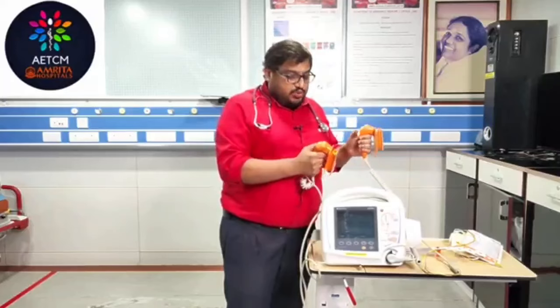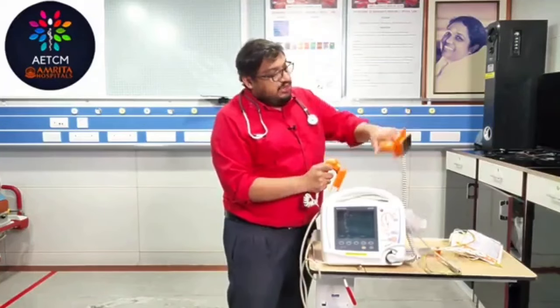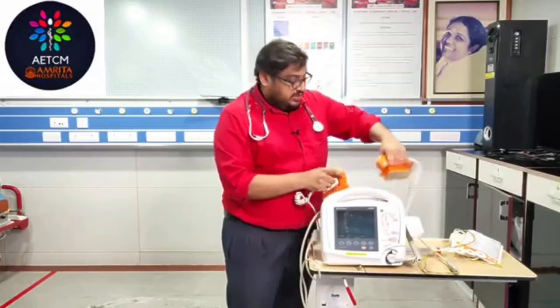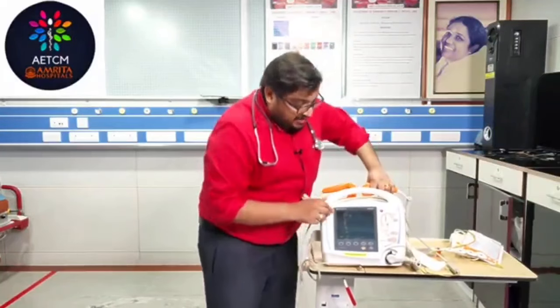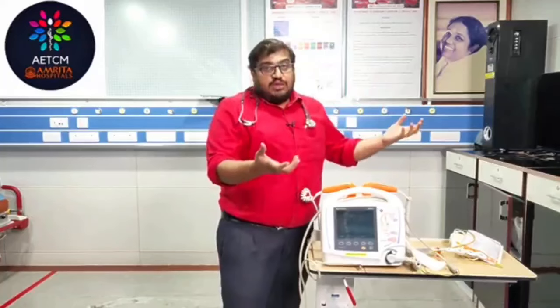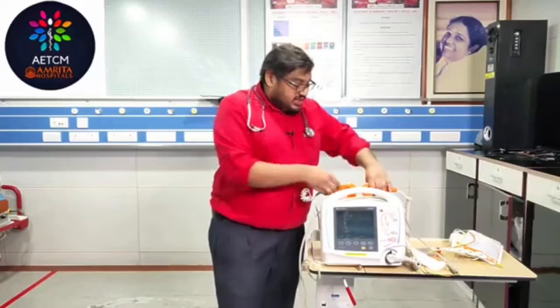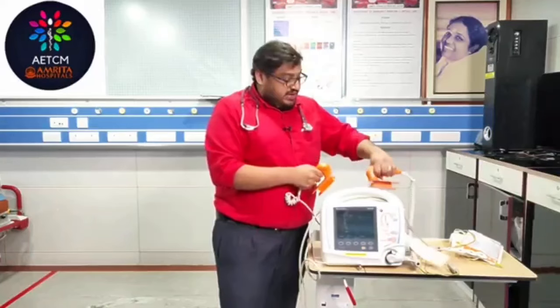So at this point, what you need to do, there is something called a charge button here. There is a charge button on the side. You can see the charge button here. This is the charge button. Or else you will have a charge button here also. So you need to charge the defibrillator. Then only the paddles will have that energy. Once it is charged, you apply the paddles wherever it is indicated.